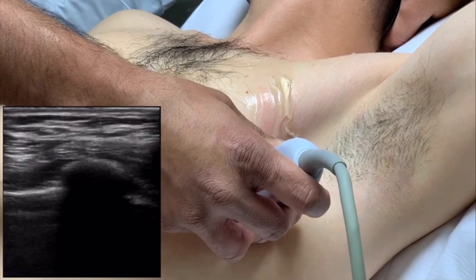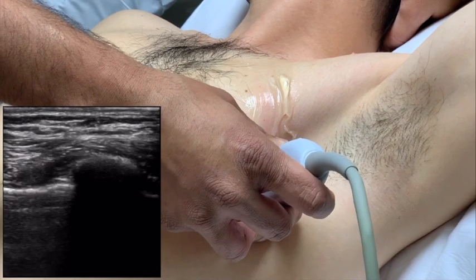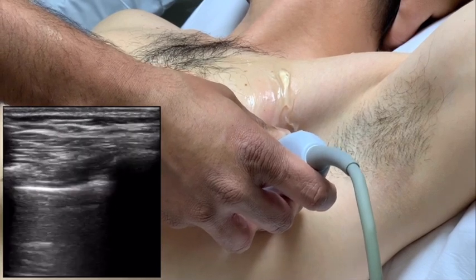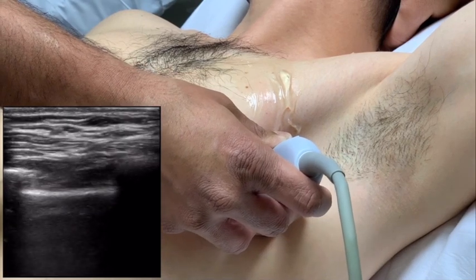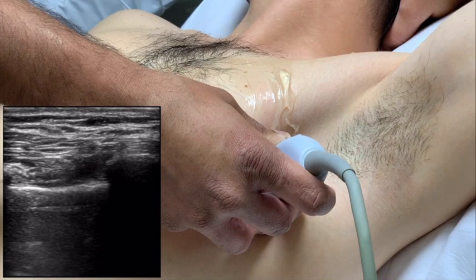So here we're scanning, and you can see the rib. And you can see the pleura sliding in between the ribs. And the serratus muscle sits right on top of the ribs. And again, some people will do the injection above the serratus muscle. Alternatively, you can go below the serratus muscle, depending on what type of spread you want in this area.